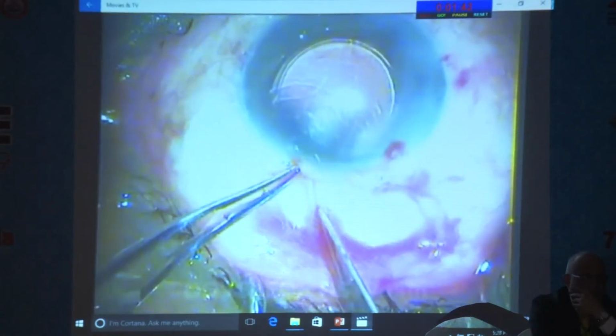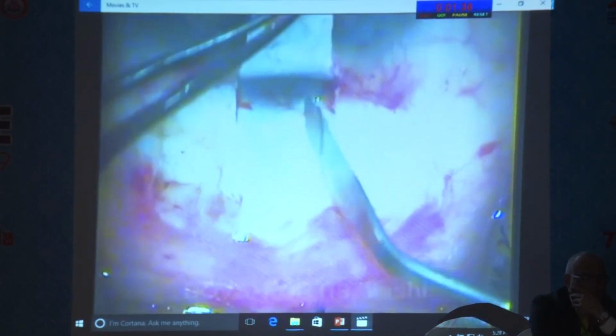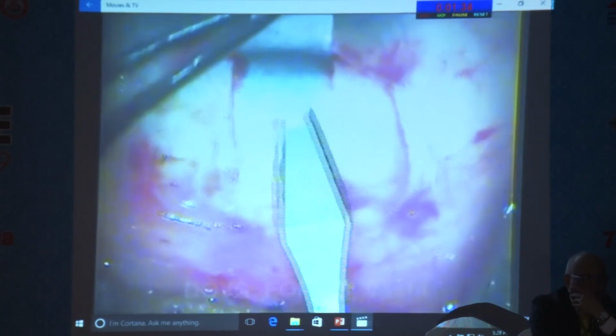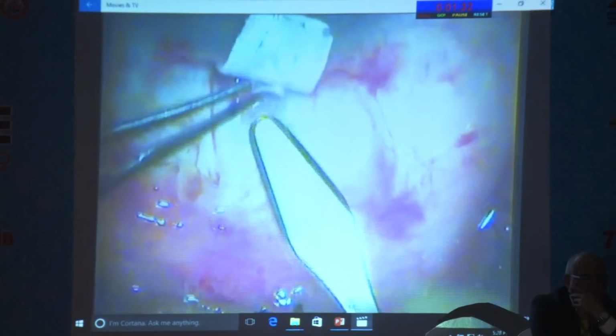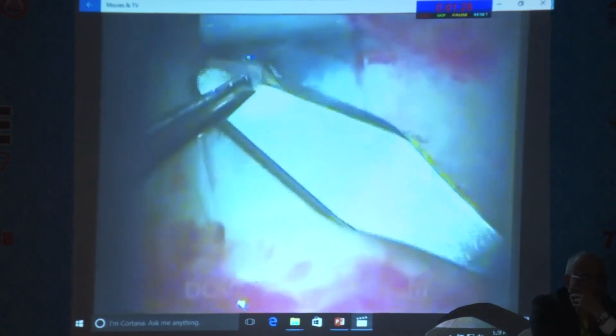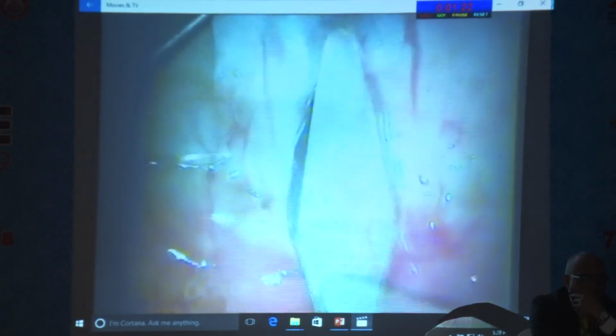The superficial flap is removed first, followed by the deeper dissection. We go right up to the outer cornea, and then we go deeper down, right up to the Descemet's membrane. We remove the pre-Descemet's layer, as can be seen in this surgery. After that, we can see the aqueous fluid coming out, which is then confirmed by injecting.